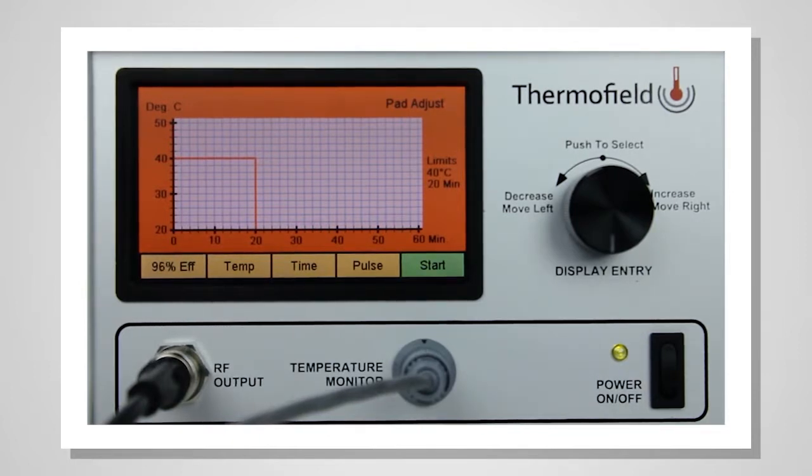At this point, the unit is allowing low RF power to the applicator and measuring how much power is absorbed in the patient. If the applicator has not been applied to the patient, the pane will display 0% efficiency.